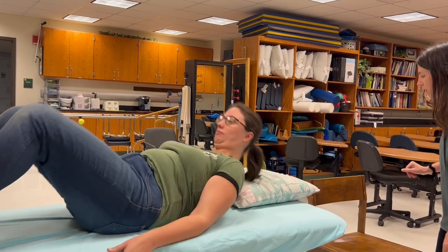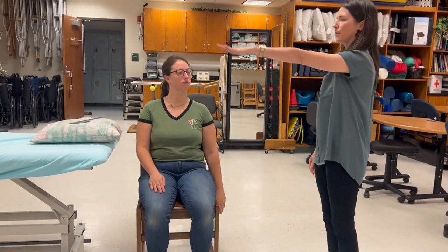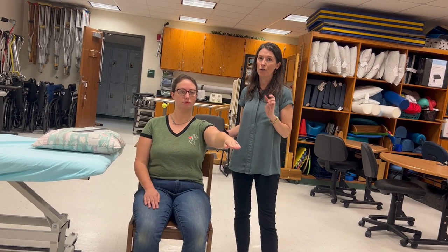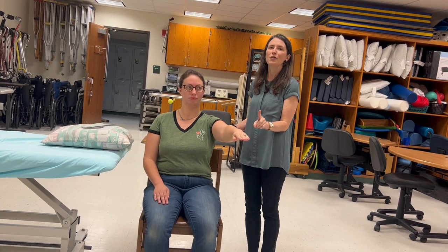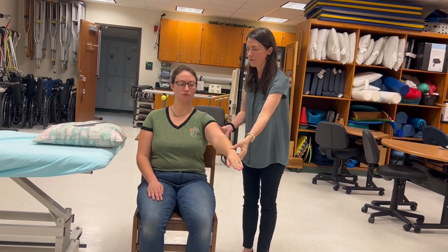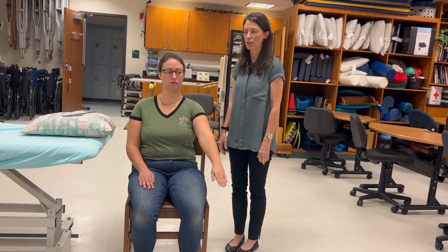Now we have her sit in a chair because we're going to do MMT. For MMT of shoulder flexion, they're sitting in a chair, arm by the side, and they bring the arm up with palm facing the floor just up to shoulder level. For a grade three they only need to go through 90 degrees. If she goes through the full 90 degrees that's a three. If she can do more than half but not the full 90 we'd call that a three minus, and if she comes up a little but not even half we call that a two plus.